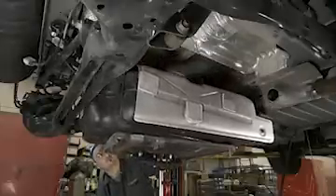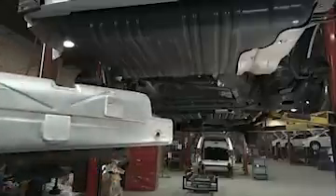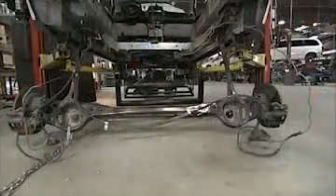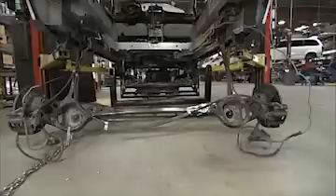The team also removes the 76-liter fuel tank. They'll replace it with one of the same capacity to fit the new configuration. They cut out a large section of floor and relocate displaced wiring. They're now ready to roll the new floor framework into position below the vehicle.